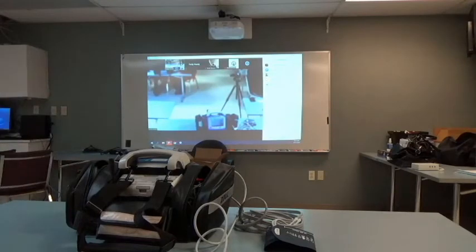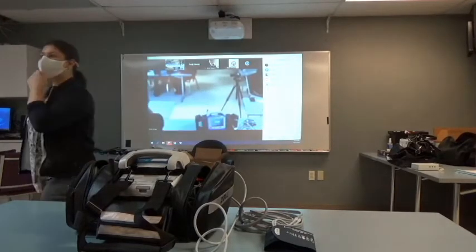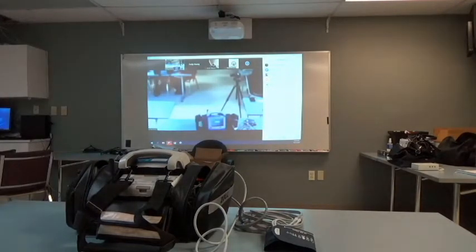All right. So if you haven't already, please press the home key. The home key will take you back to that original screen with that waveform for your 12 lead, so you can see the 12 lead. And then just take a look at your picture. If you like the picture, press the 12 with the camera, please. When you press the 12 with the camera, you're going to get a brief stop sign. That's in case the patient starts to move. Then you can cancel the transmission. We're going to let it continue right now.